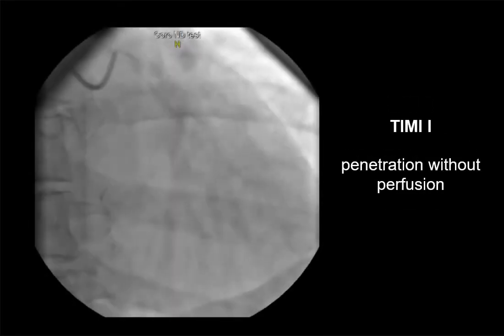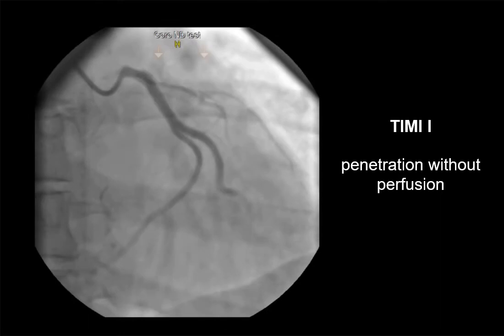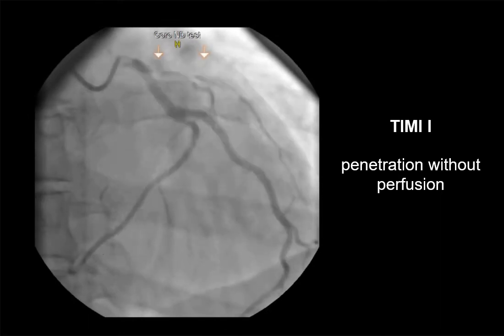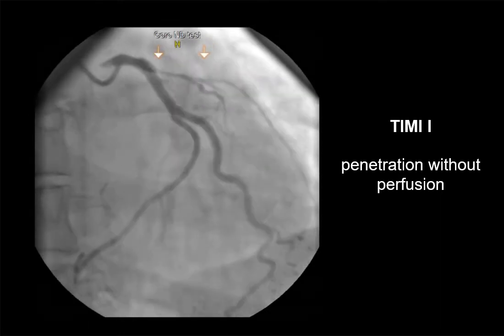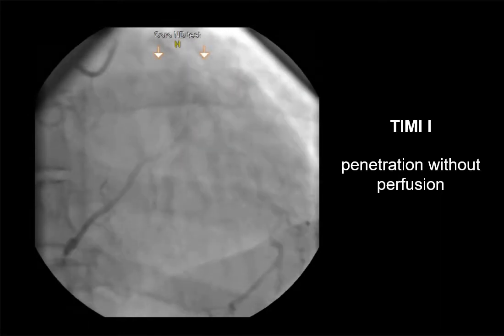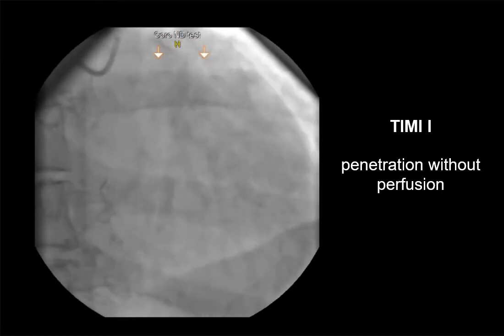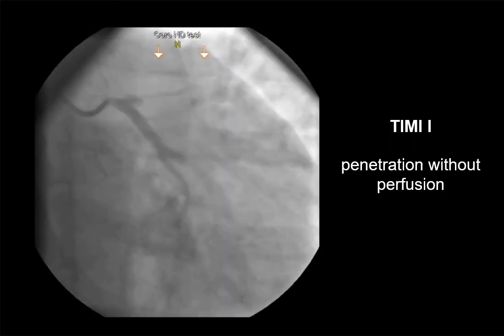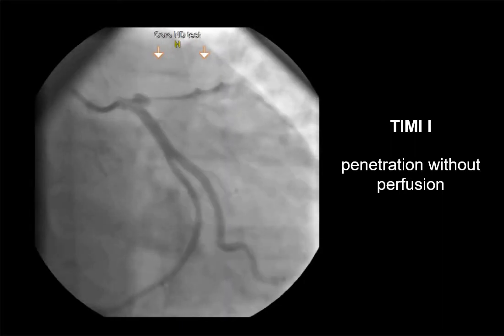TIMI one flow — penetration without perfusion — is faint antegrade coronary flow beyond the occlusion, with incomplete filling of the distal coronary bed.